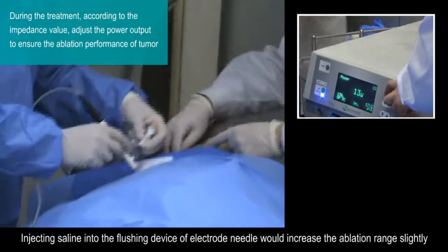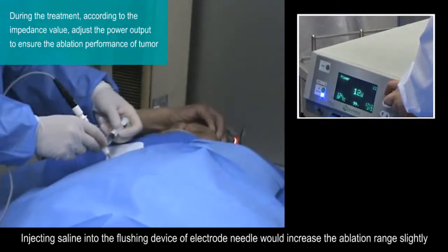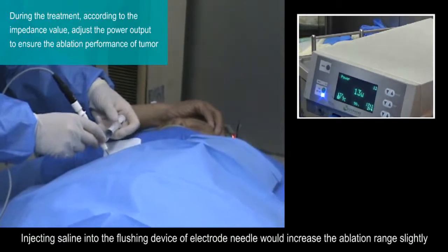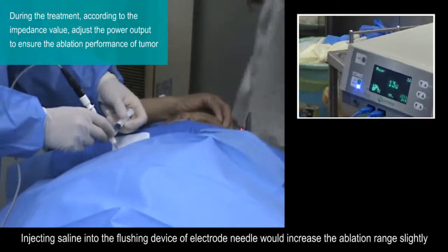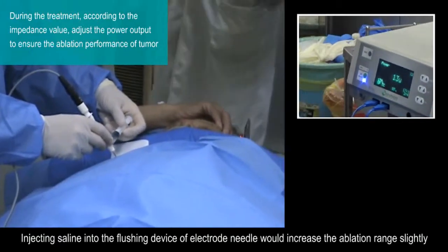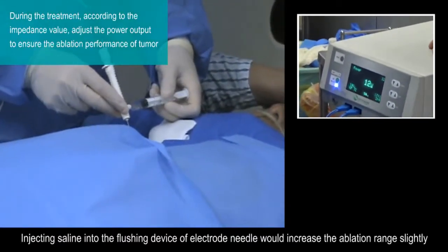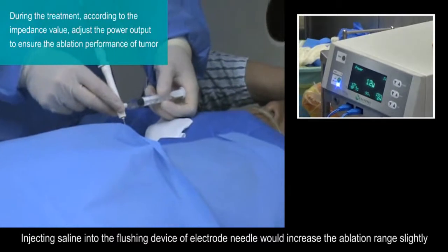Injecting saline into the flushing device of the electrode needle would increase the ablation range slightly.